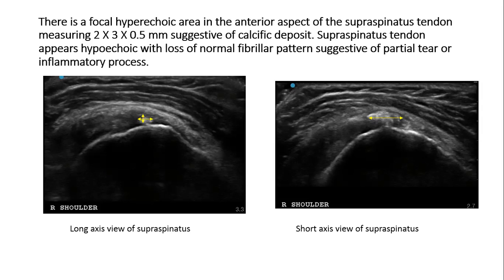Sometimes tear and inflammatory process are difficult to tease out, and it's okay to say this can be this or that. If you look at other imaging reports like MRI or X-ray, they also make suggestions based on what they're seeing. So no imaging technique or modality is diagnostic of anything, right? We look at the grayscale images and try to interpret them based on the clinical presentation or physical findings, and try to determine what kind of problem this patient is presenting with. So there's always clinical correlation.